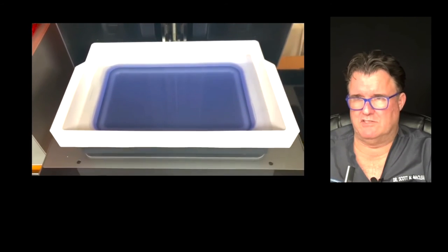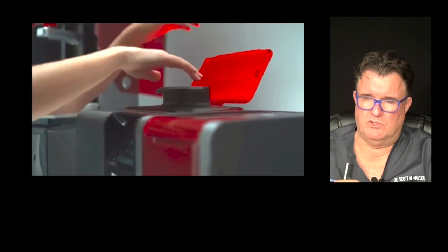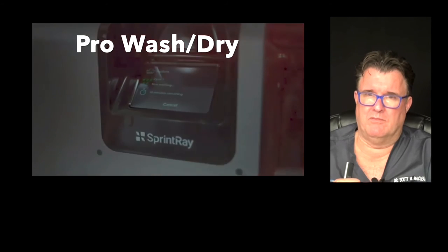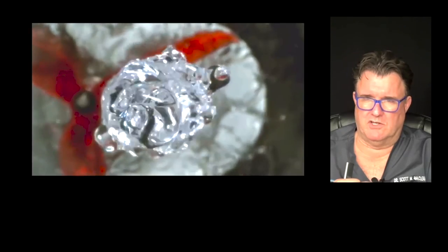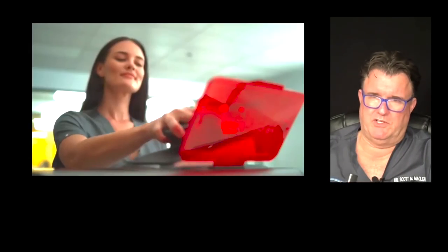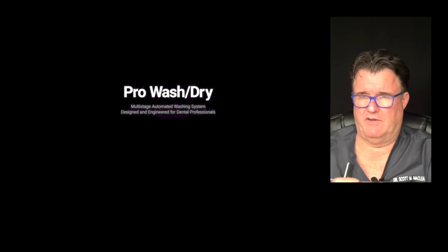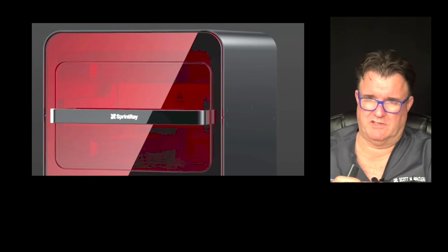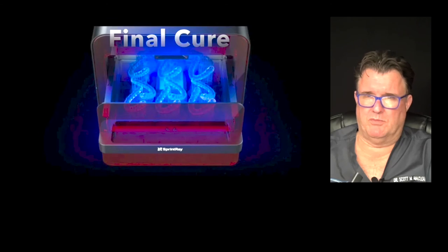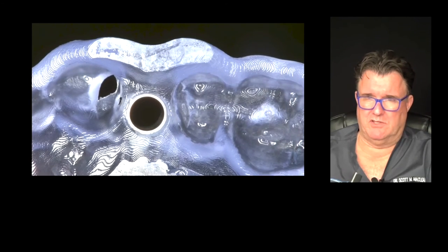We place the PLY file in the printer and push the print button — just like putting ink and paper in a regular printer. There's the SprintRay platform with three different templates being printed using DLP light, which generates the power to cure the resin in a very accurate way. The three files are taken off the platform and put through the wash and dry first, then the cure. These machines are very efficient and self-contained — no open chemicals or smells in your dental office. Once in the Pro Cure 2, you separate the templates and cement the ring for guided surgery.